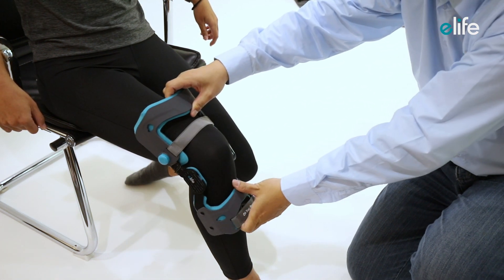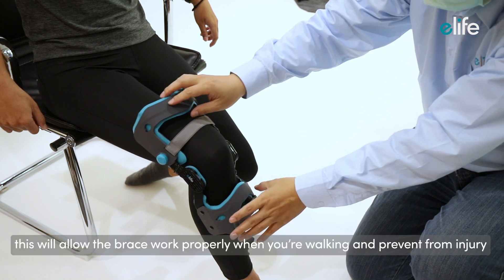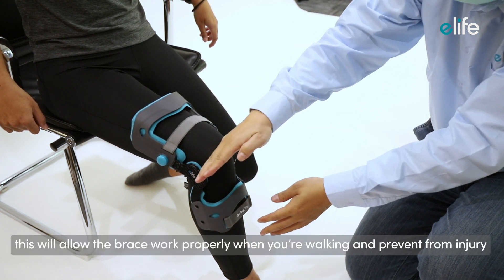Put the brace on the leg. Position the center of the hinge slightly above the center of your patella. This will allow the brace to work properly when you're walking and prevent injury.